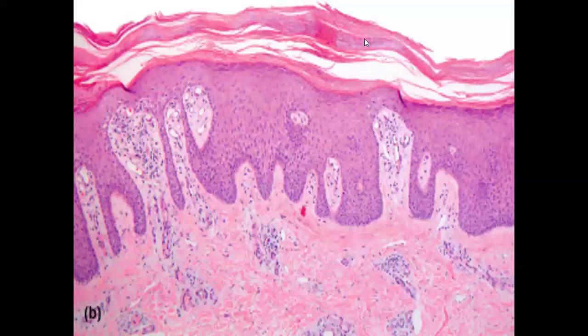By parakeratosis, we mean that the keratinization in the epidermis is deficient or rapid, whatever the reason, and as a result the cells from the basal layer are rapidly transforming and entering into the stratum corneum, but in this process they are unable to lose their nuclei and retain them. So when there is a thick parakeratotic column, the granular layer will be deficient. In addition, you can also notice the epidermal hyperplasia.